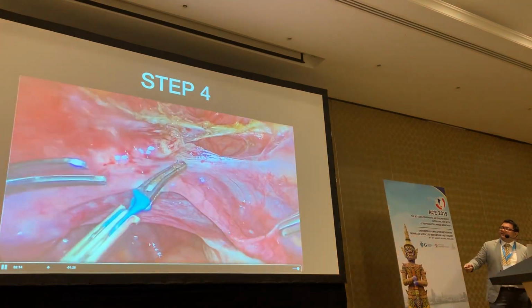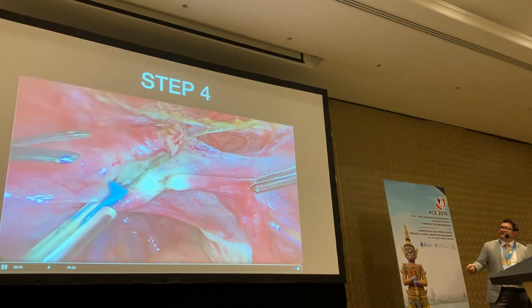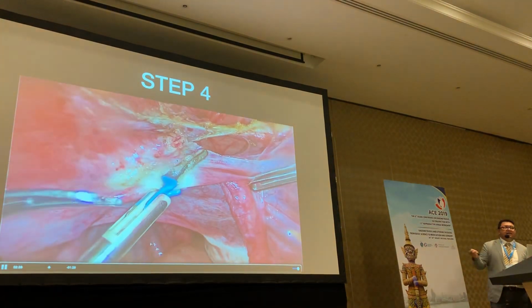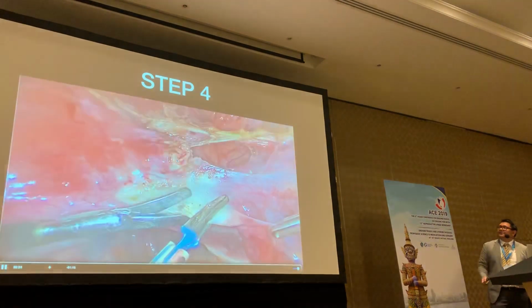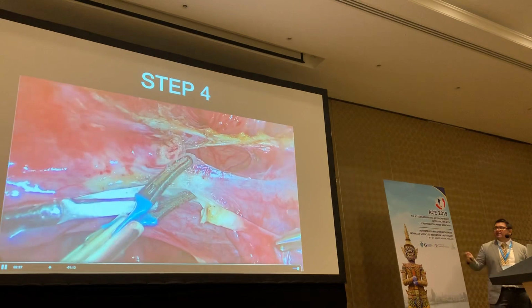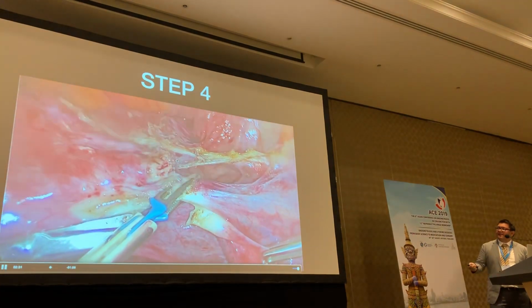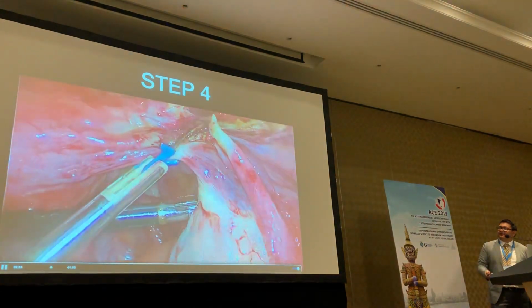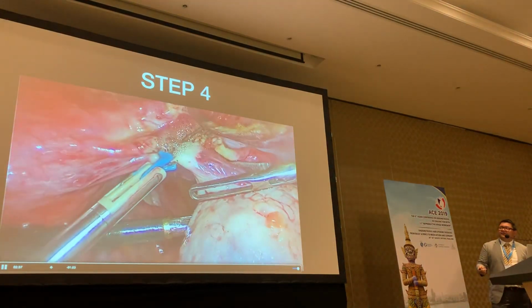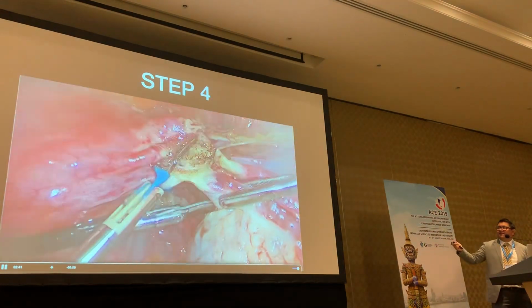So again, you can see some fibrosis from the scar. This right tubo-ovarian structure is very easily accessible to my right hand, and as you can see, I'm aiming for that hole down there. So it's quite like joining the dots. Here you can see it's not really ergonomically correct as I proceed, but I'm kind of getting away with it. And you can see there's only been 3 of these instruments for this part of the case so far.